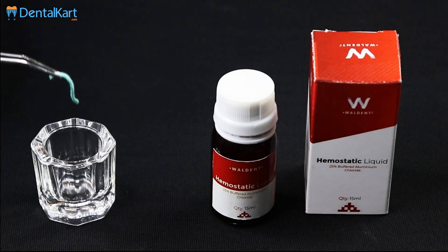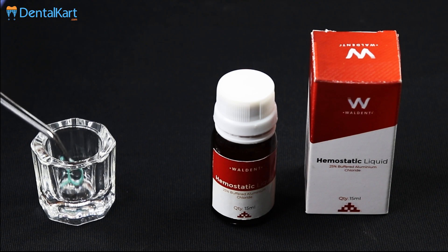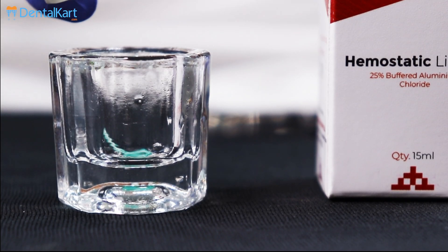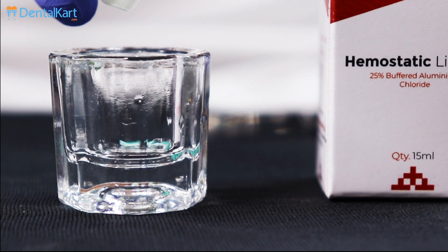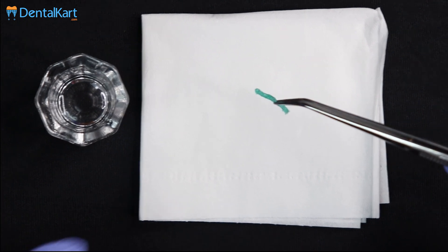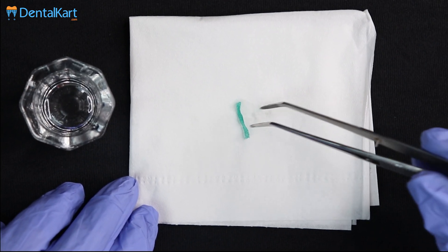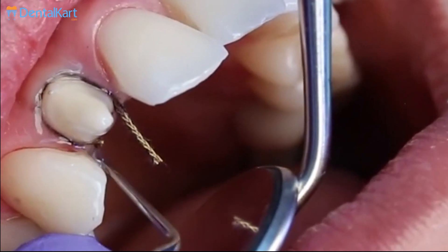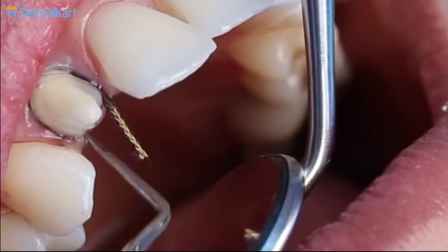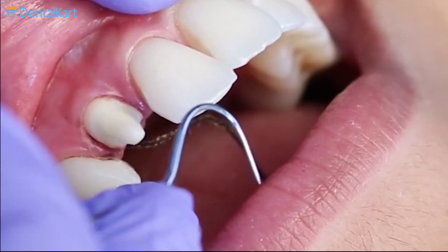When using hemostatic liquid for impression making, take a required length of gingival retraction cord and place it into a dappen dish. Pour an adequate amount of hemostatic liquid into the dappen dish and drench the gingival retraction cord completely. The excess hemostatic liquid should be blotted on a cotton tissue before placement. Then place the dampened retraction cord inside the prepared tooth's gingiva to control gingival bleeding prior to impression making.